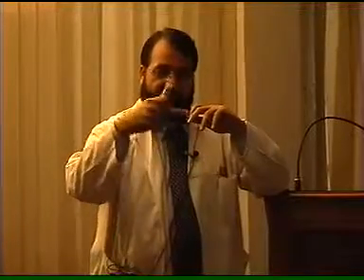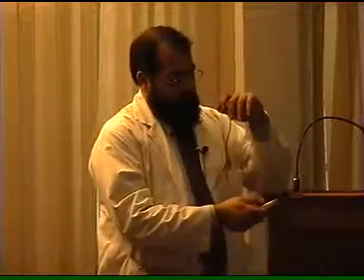Similarly, the cardiac vector is going away from the right side, so the QRS complex will be negative as a rule in AVR. AVR is profoundly negative, because the cardiac vector in a normal person is going away. If that is positive, it means there's a very big problem: a swing of axis and a superiorly directed vector. So that's abnormal.